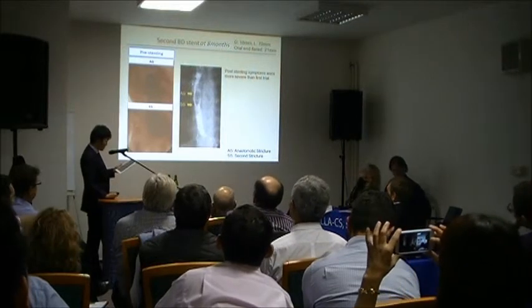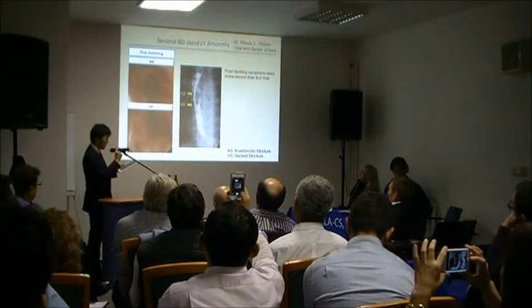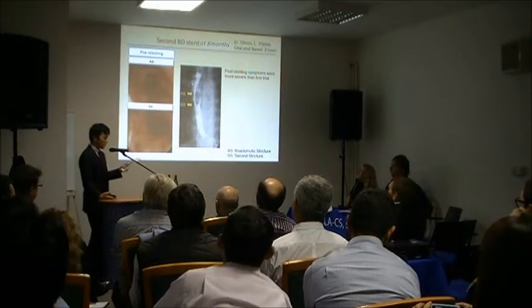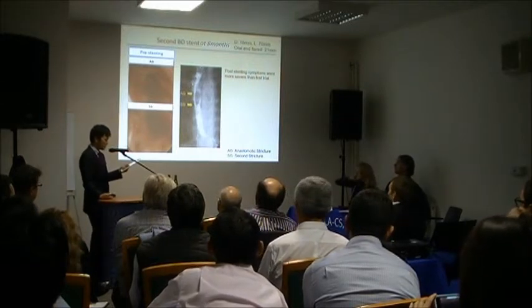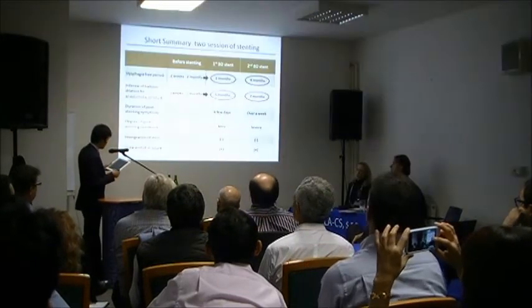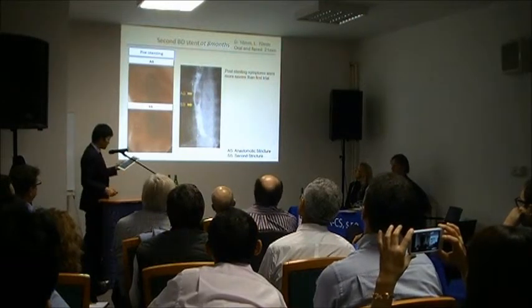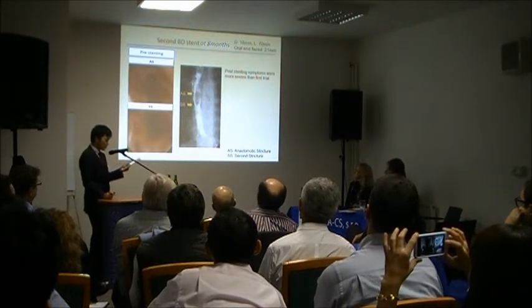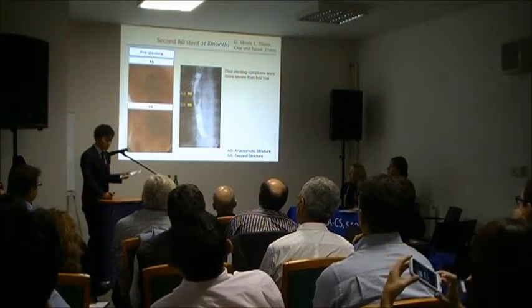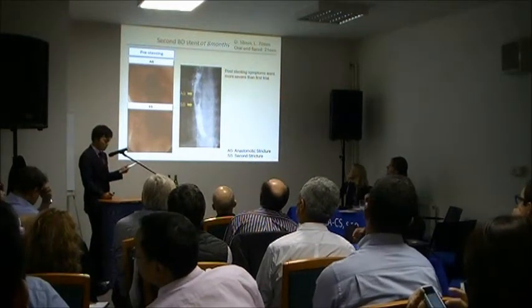As the next intervention, she and her parents desired to insert the stent again. Therefore, a second stenting with the same type of 18 mm diameter but a longer, 70 mm stent was performed, in order to dilate both the anastomotic stricture and the second stricture. Postoperative chest and abdominal pain and vomiting were more severe than in the first trial, and she required strict pain management for the first few days.